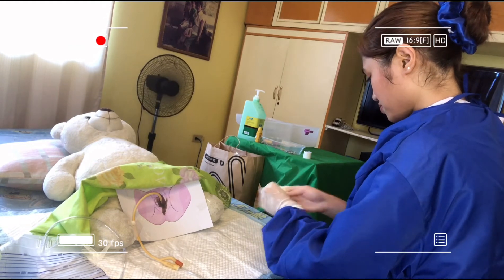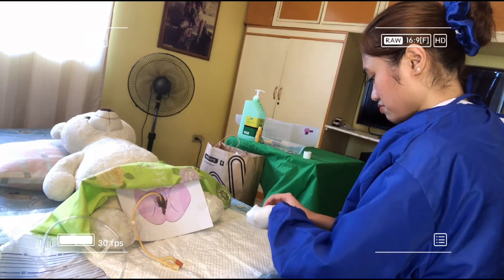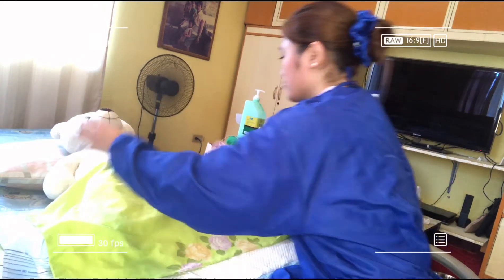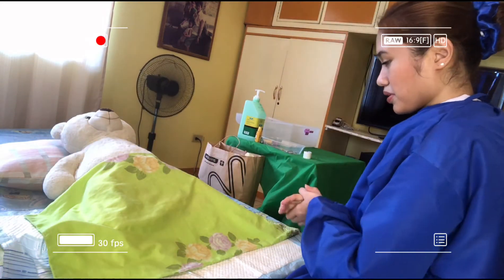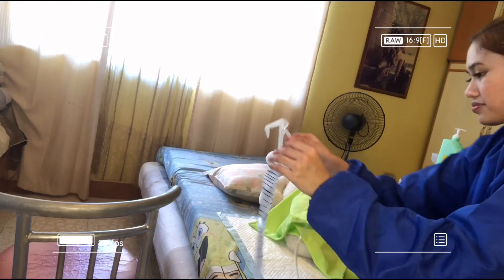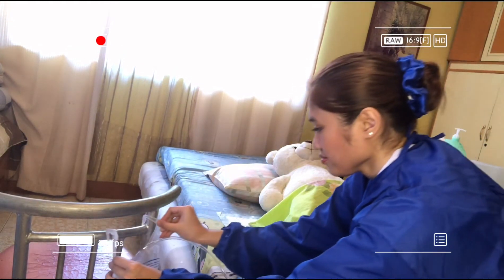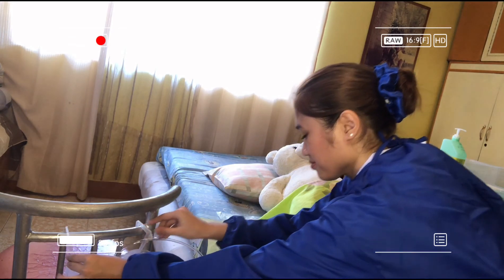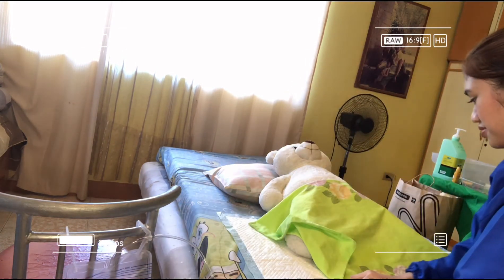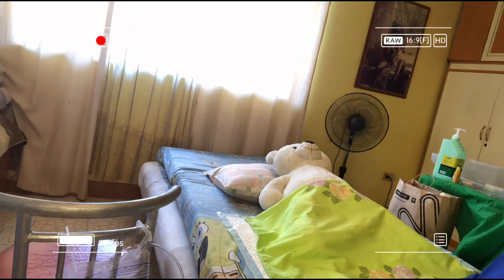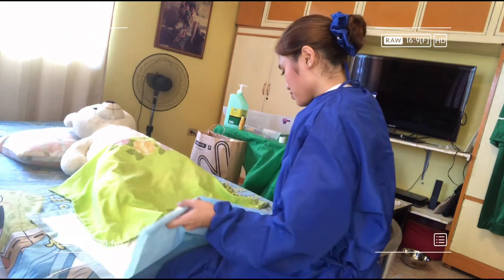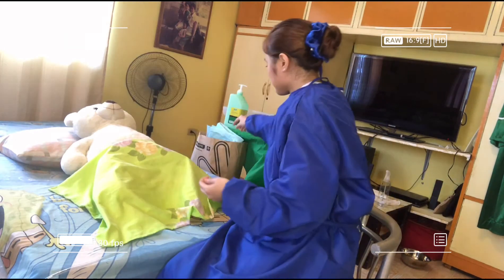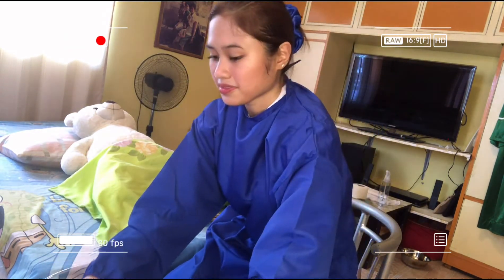Remove gloves, dispose of equipment, and wash hands. You can now cover the genital area. Ms. Lopez, I am done inserting the Foley catheter. I will now place the drainage bag below the level of the bladder. Do not let it rest on the floor. Make sure the tubing lies over, not under, the leg. Dispose of the waterproof pad. Assess and document the amount, color, and odor of urine.